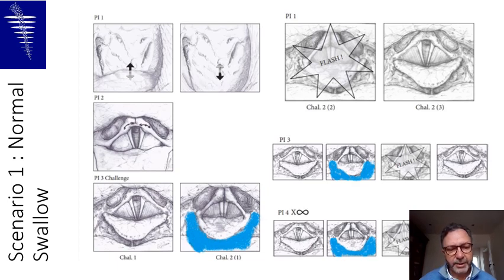At point of interest number 3, you will start the challenge with the methylene blue. Of course, you will check for any residue within the pharynx, what we call the 4 quadrants of the pharyngeal larynx, which is basically the 2 valleculae here and the 2 piriform sinuses here. When the patient is asked to swallow the methylene blue, you will see the methylene blue coming, and then you will have a big white flash on your endoscope, which signifies the contact between the endoscope and the soft palate.